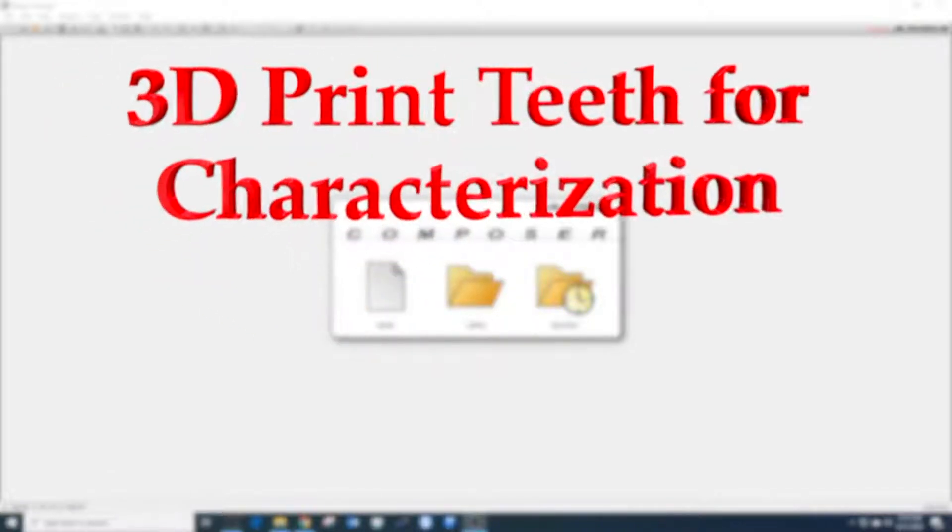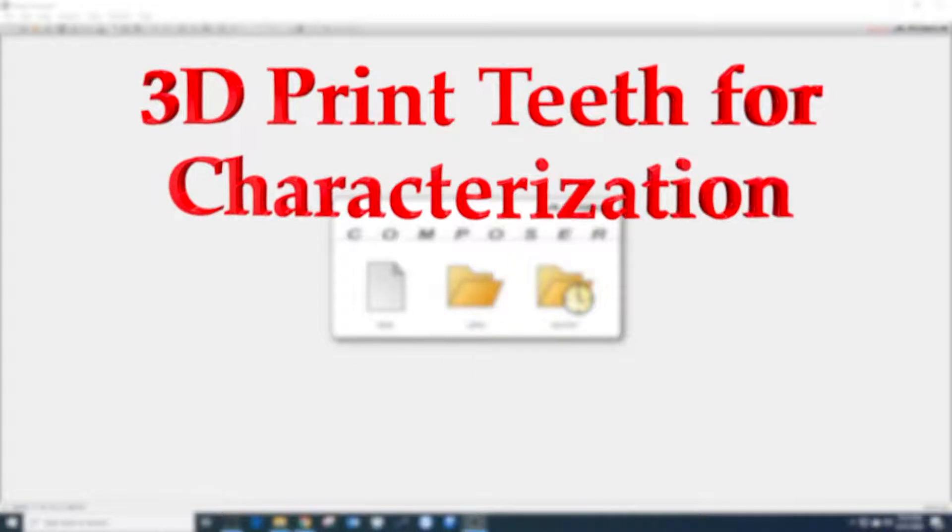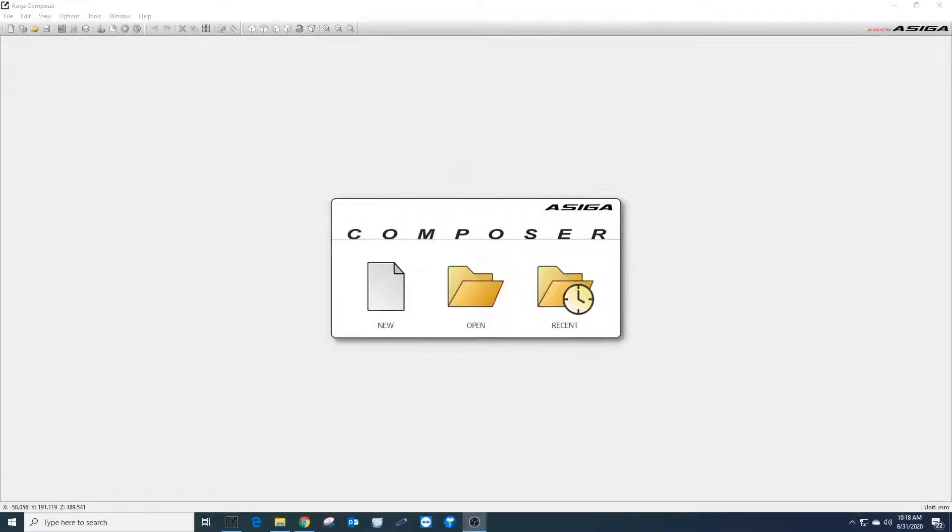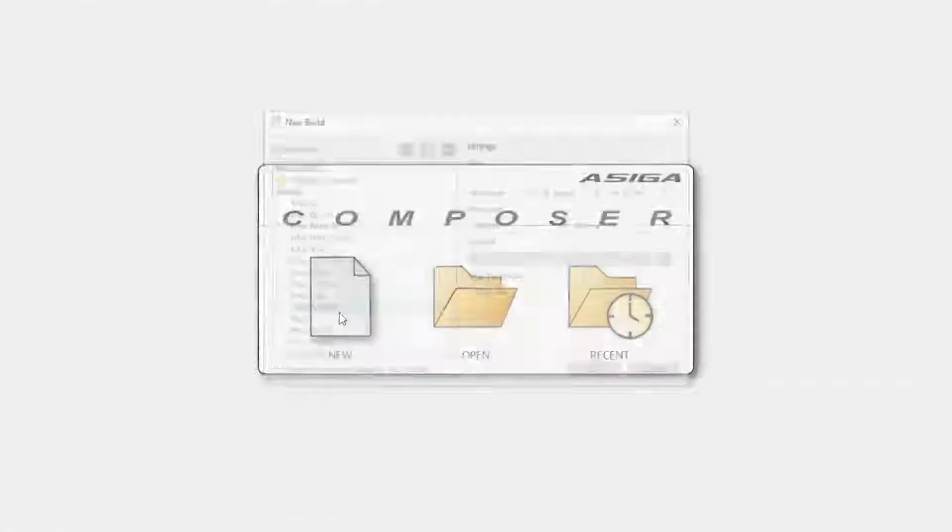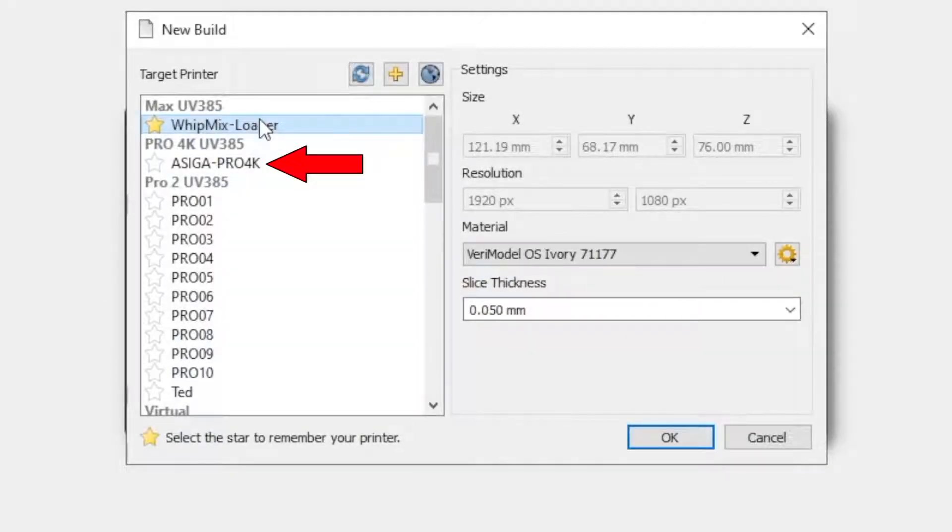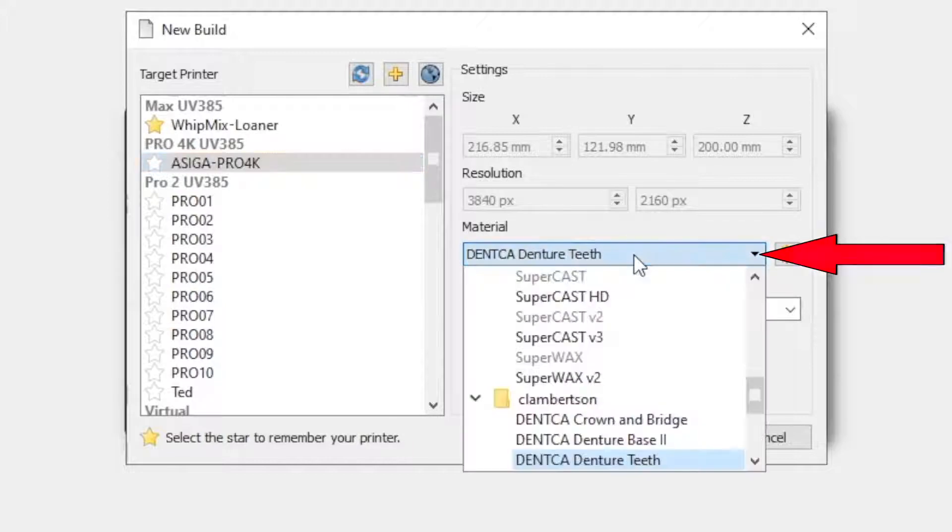How to 3D print teeth for characterization. Start by selecting the new build option when the program loads. Locate the preferred printer for use and select the material to use for the print.